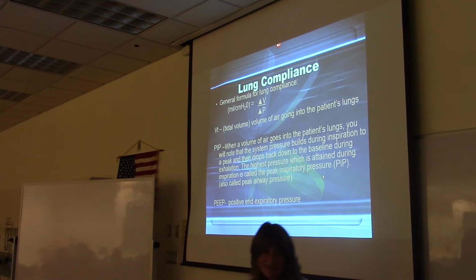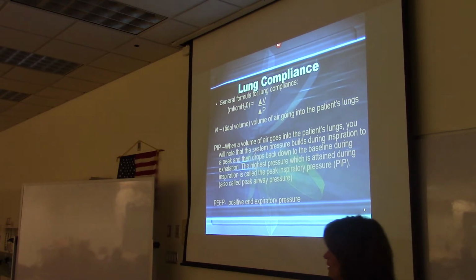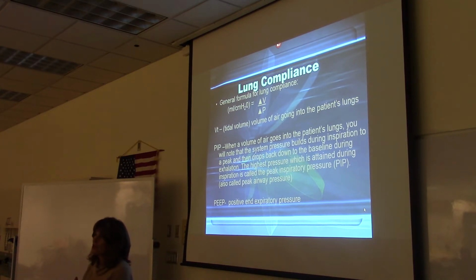The reason why is that there's another setting called PEEP, which stands for positive end expiratory pressure. I'll tell you something real quick about PEEP, but we have a slide coming up where you're going to write down more information. One thing that helps with oxygenation is at the end of exhalation, instead of exhaling all of your air, if you keep a little bit of air in your lungs, it improves oxygenation. So if you keep a little bit of air in your lungs, then you're keeping a little bit of positive pressure in your lungs, and then oxygenation will improve.